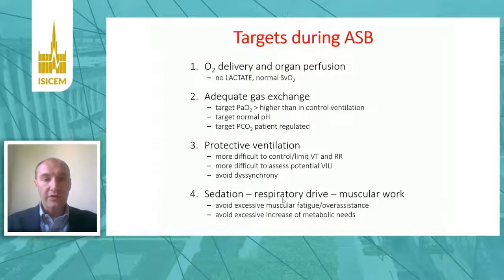As during controlled ventilation, we aim to protective ventilation targets, so tidal volume and transpulmonary plateau pressure and transpulmonary pressure. Clearly, during spontaneous breathing, since the patient may have a very high drive, it's more difficult to control and limit tidal volume and transpulmonary pressure.